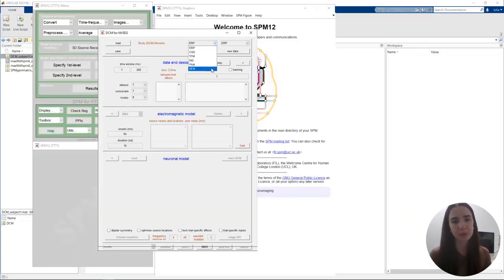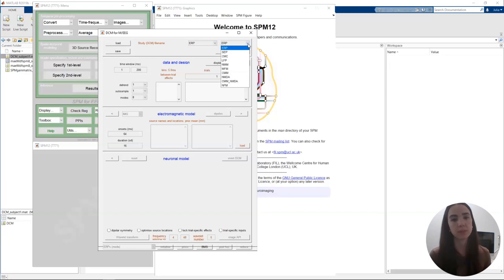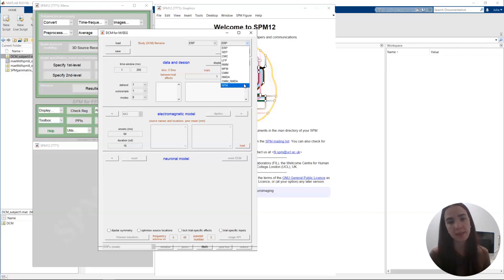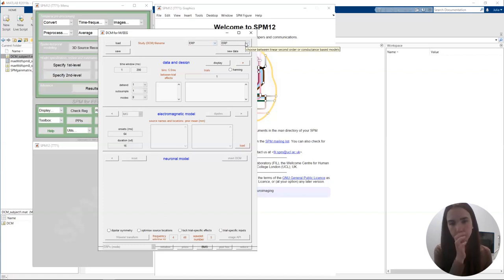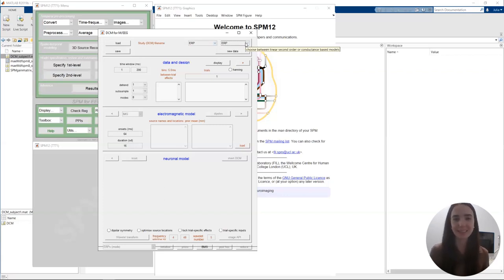We're going to select ERP in the first drop-down menu — this is where we choose our observation model. Then we have a second drop-down menu with options like CMC, CMM, CMM NMDA, etc. If you want to know what each of these drop-down menus are, you can just hover over them and you'll see a message that appears explaining what each menu is and what you have to do at each step. This is very handy if you're starting to use DCM and don't know exactly what it's asking you to select.